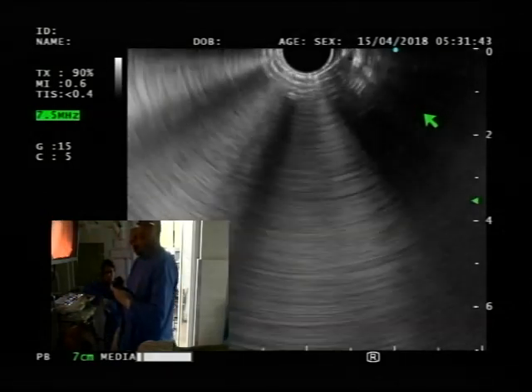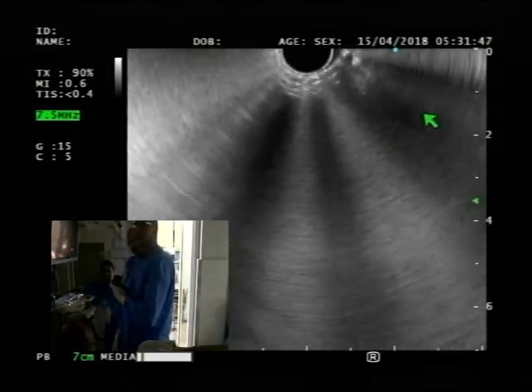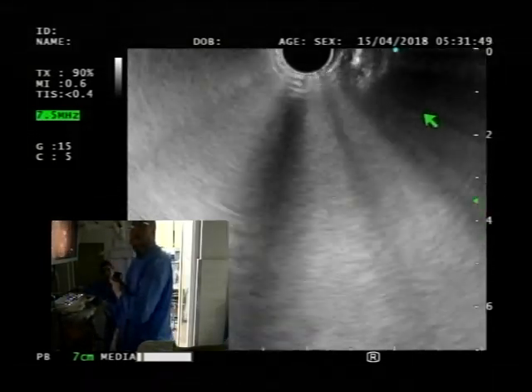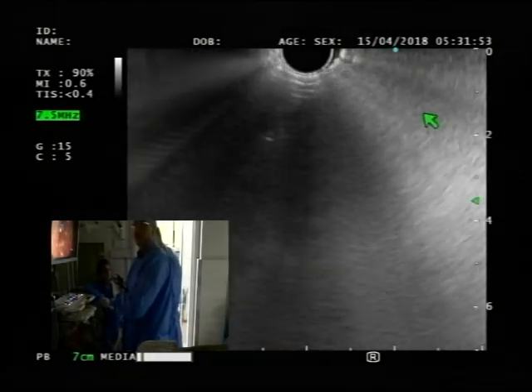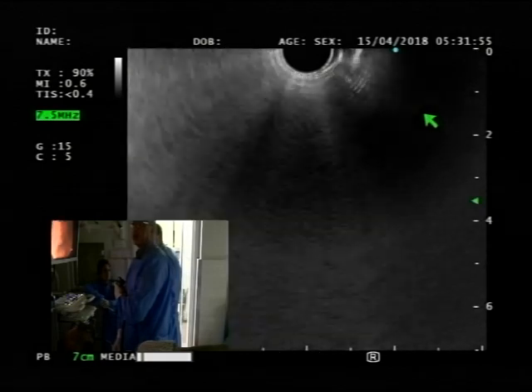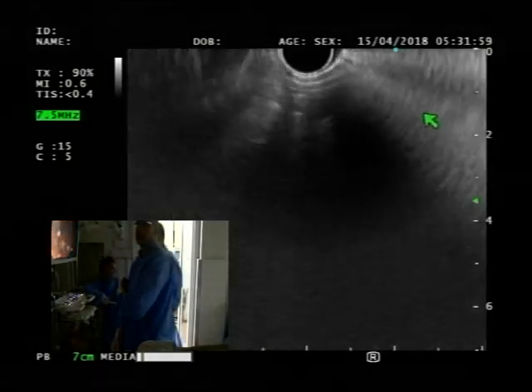No, that's fine. If you're there, that's good. But my point is that those movements, the counter and clockwise, need to be large enough for you to actually scan the area properly. Hitting a vessel, that's okay.